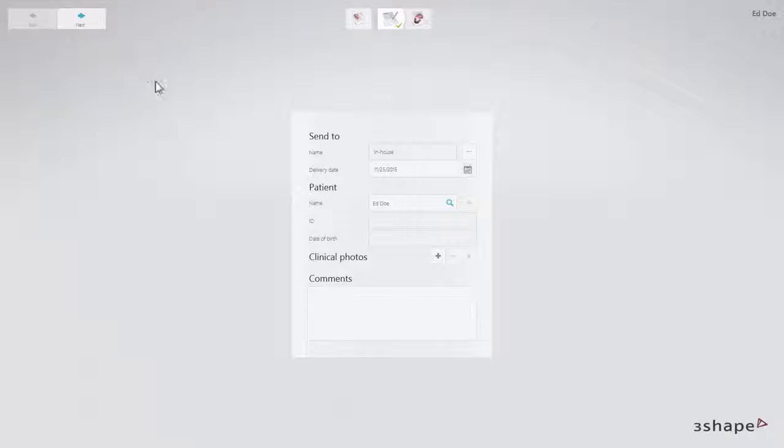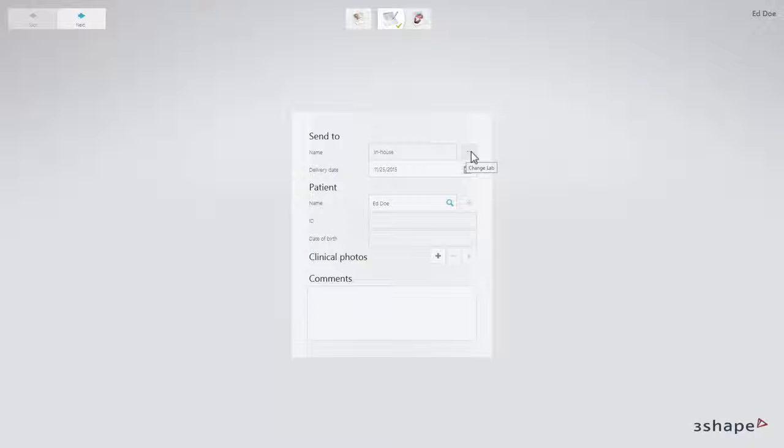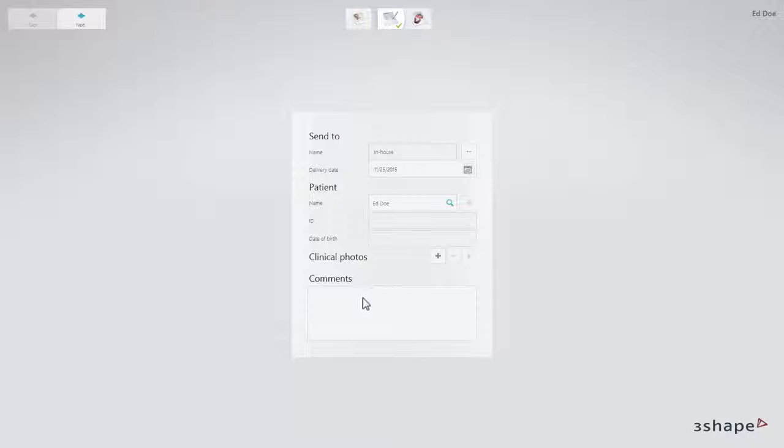If needed, click Change Lab icon to select a different lab. When the Indication Settings page appears, enter the patient's information, add photos and comments if necessary.